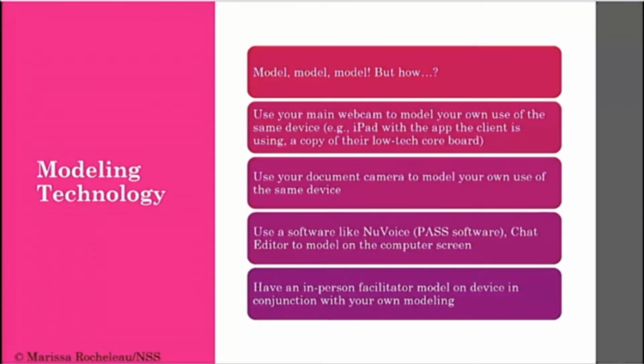Now that we have an underlying foundation of the effectiveness and feasibility of online AAC, let's talk a bit more about how we actually implement the technology. As we mentioned, modeling is incredibly important in the effective delivery of any AAC service. One way you can achieve modeling online is by using your main webcam to show your use of the same device, such as your iPad with the same app installed or a copy of the low-tech core board.